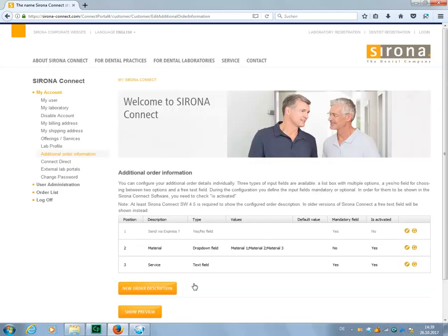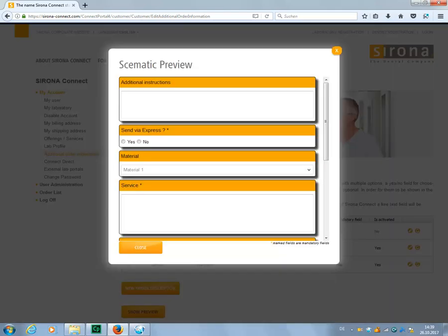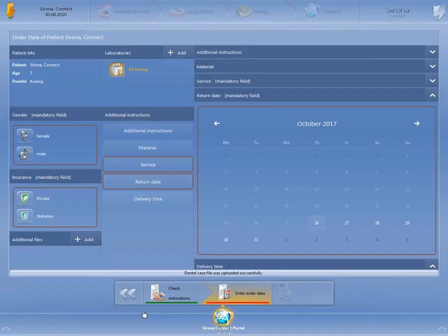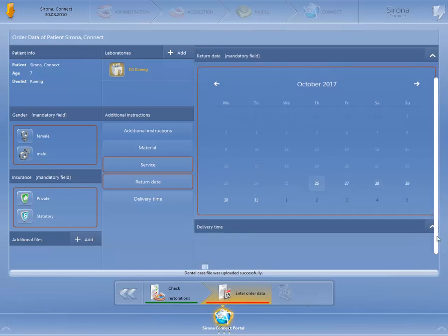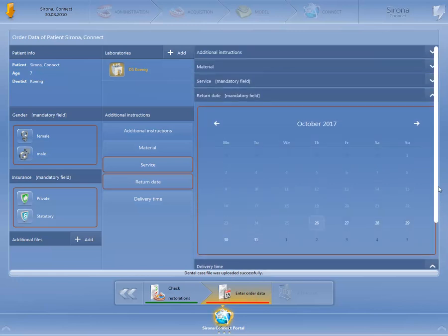Next, let's take a look at the preview of our order information. All changes are now shown and we can then check the view in the Sirona Connect software. As you can see, the preset order form fields, as well as the newly created additional order information which we earlier set to Is Activated, appear. The order information with a Yes-No field and the query regarding Express Shipping are still not visible to the dentist.